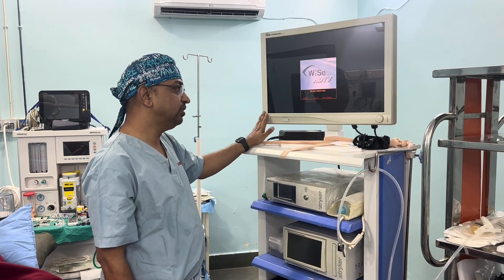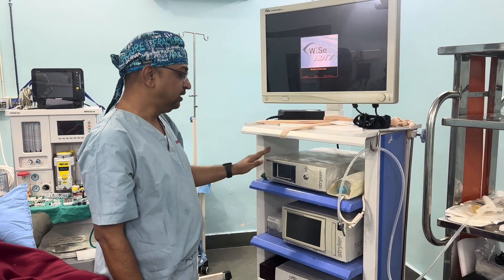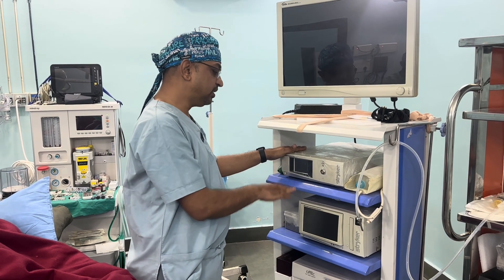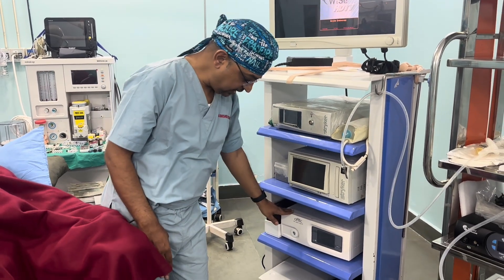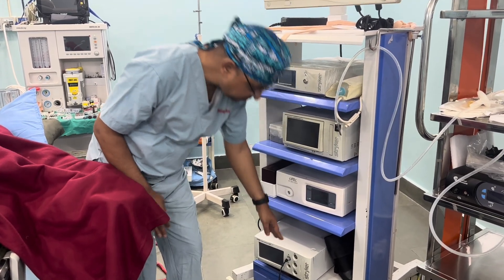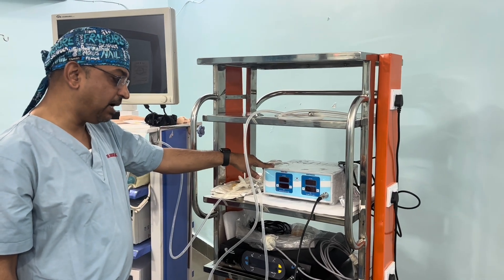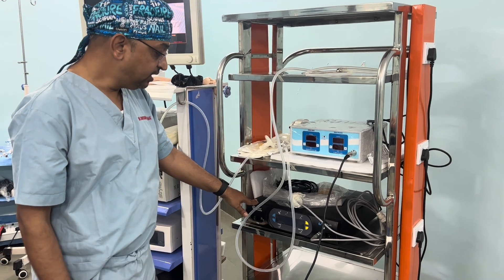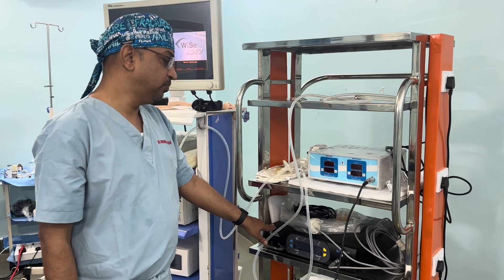On top of the trolley is a medical grade monitor. We also keep a camera console, a recorder system, an LED light source, and a shaver system. In addition to that, we have an arthroscopic pump and an RF ablator that we use specially in shoulder arthroscopy.